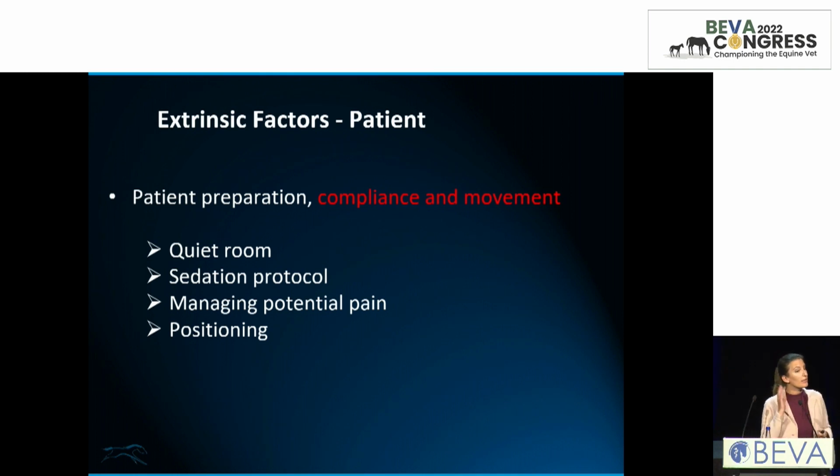So that brings me to the scan room itself. Ideally, it's a quiet room and they don't hear other horses walking past. As I mentioned, the sedation protocol can be very individual, depending on what we want to scan, what kind of horse it is, and sometimes also in which country you're based, with availability and preferences of drugs being used. We want to potentially manage pain, as we're expecting from horses that they stand super still for 45 minutes or even longer. And if pain is an important factor in that horse's situation, placing a nerve block may be really, really helpful.